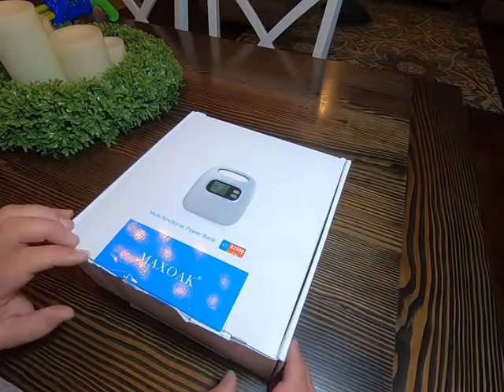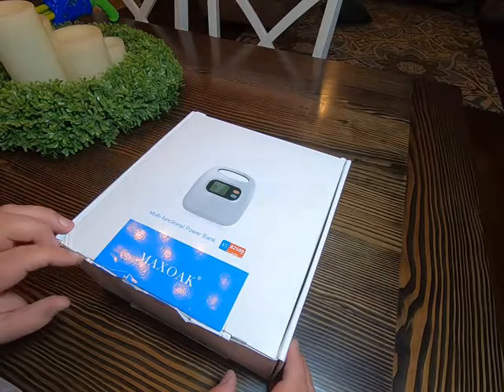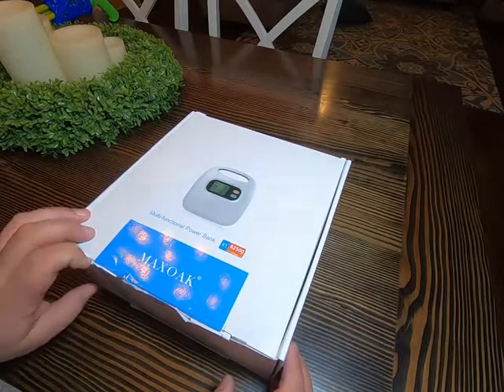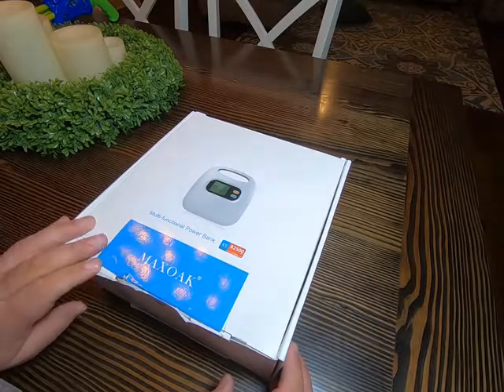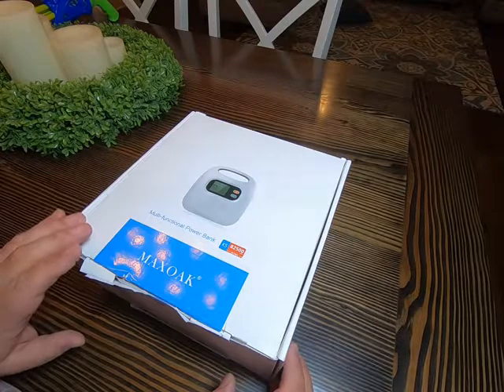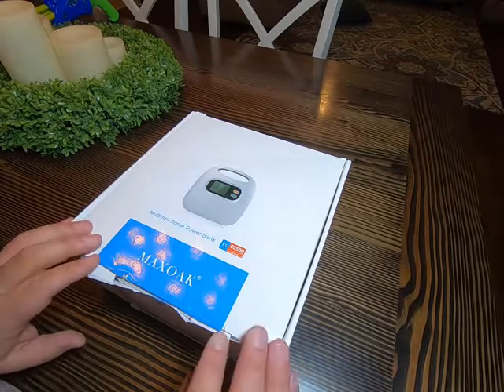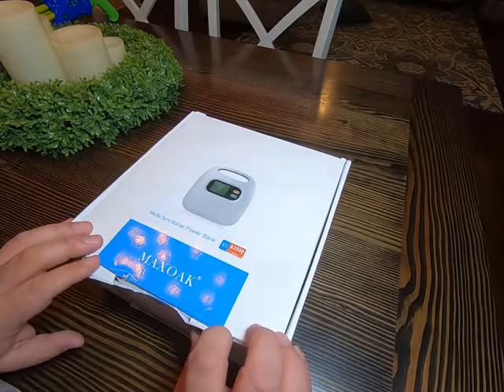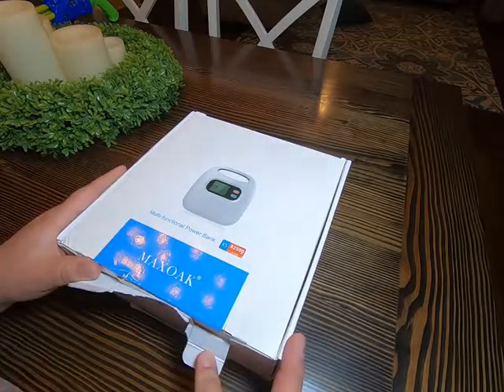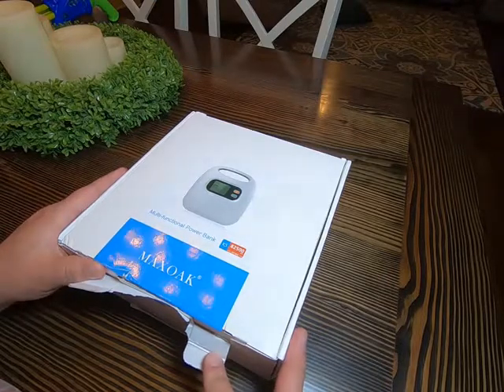This is my review of the MaxOak CPAP battery pack. I got this because I like to camp, and it's kind of difficult to do with a CPAP or BiPAP machine. I have a BiPAP, which typically takes a little more power to run than a normal CPAP, so I'm hoping this pays off and really works for what I want it to.